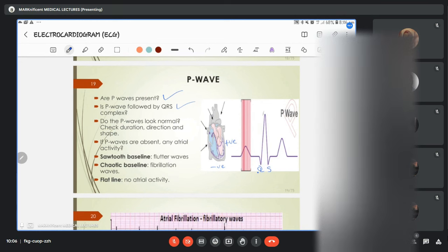By the time it gets to R, it has reached the peak of that contraction. Then gradually S is trying to release the contraction. However, the whole of the QRS is still contraction, but in different phases, maybe initial, peak, then terminal. Then by the time it moves to the T wave, it is being released for repolarization.